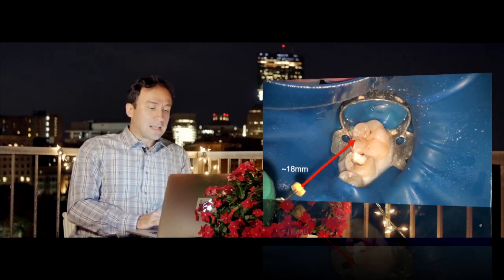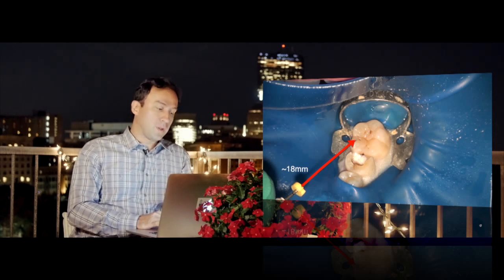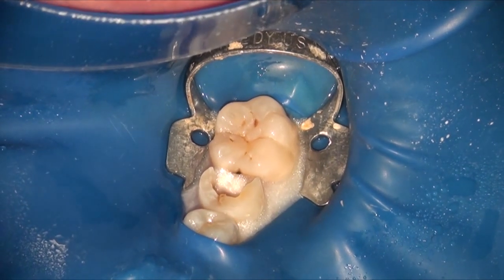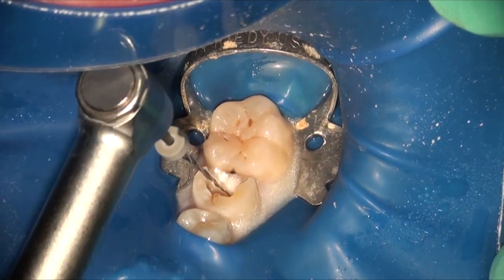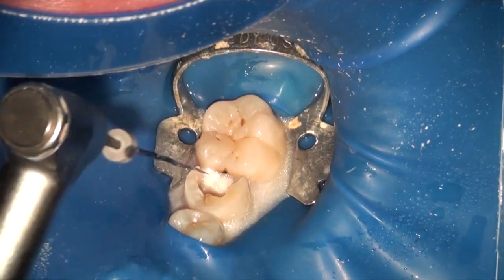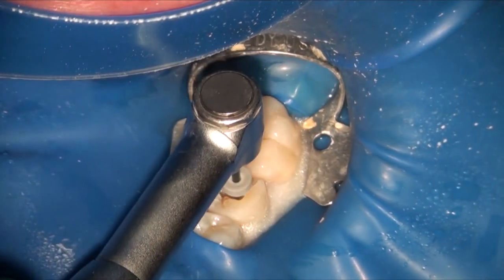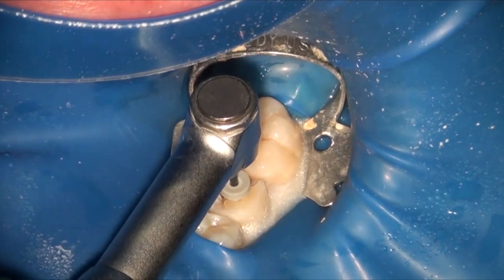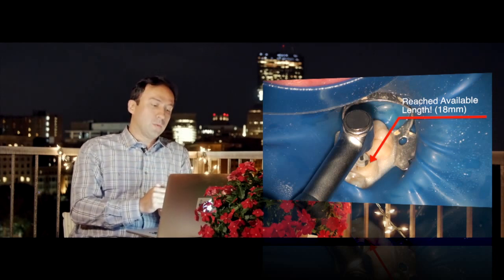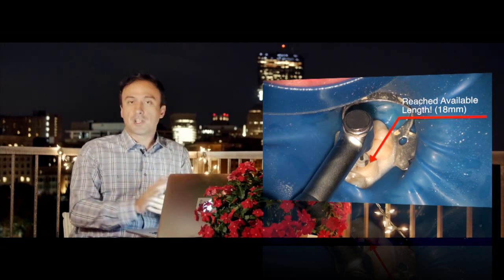We've established a length of 18 millimeters for our available length here with a size 15 hand file. What we do next is use the expediter file, which is our 1505 file, a little bit short of that length using SSC. The SSC motion is only a single stroke followed by cleaning — we're using the Endo Swipe to clean this file. This brush will be available soon, allowing you to perform your SSC — single stroke and clean — technique far more efficiently.